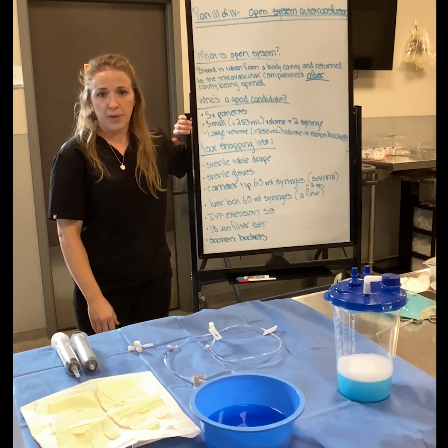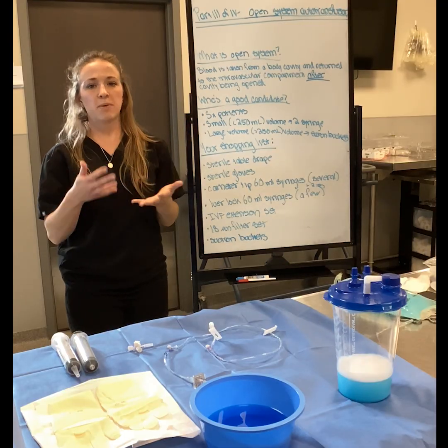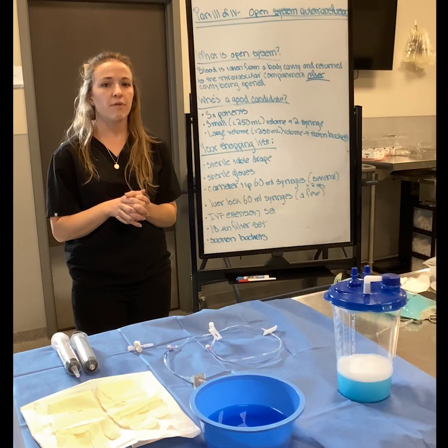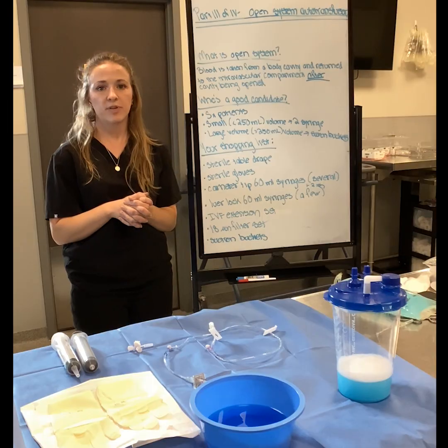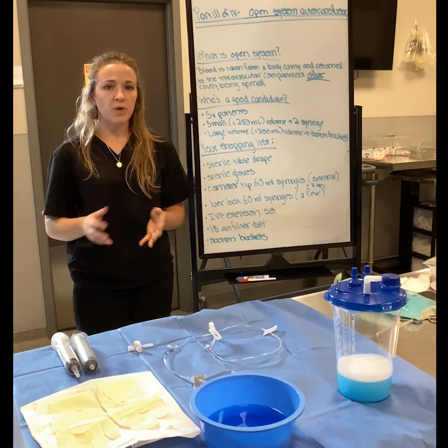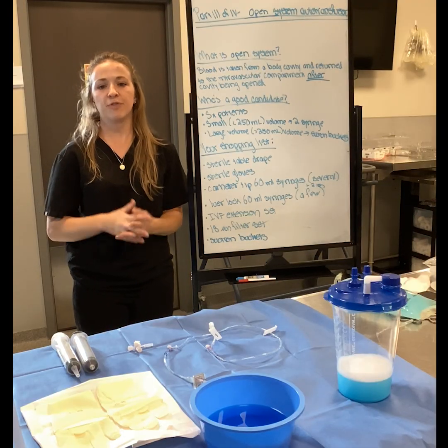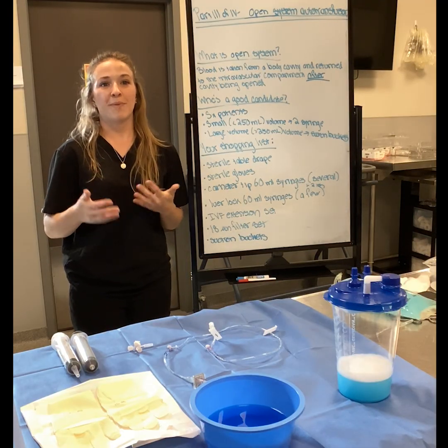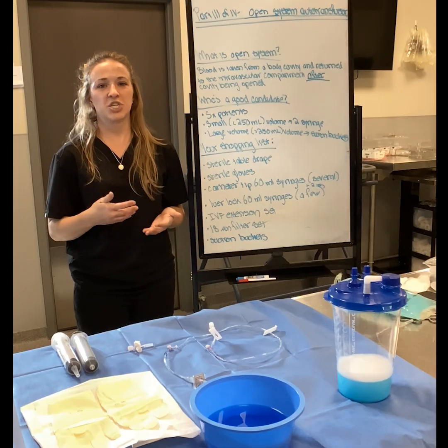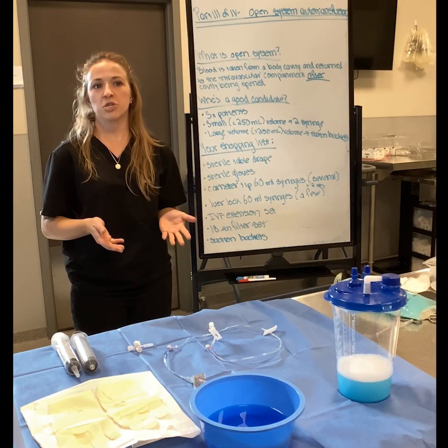If you have a small patient, maybe less than 10 kilos, or a patient that has maybe less than 250 mils of blood in their body cavity, the 2-syringe technique is going to be a good option for you. The reason why I like this for small patients is that it will not take you that much time if the effusion is small. If we think about 240, 250 mils, that's 4 or 5 syringes of a 60 mil syringe, so not that much time to do.